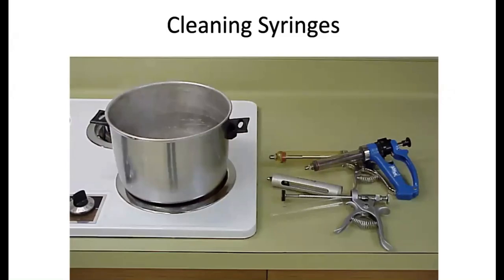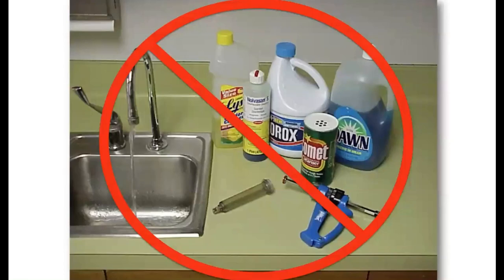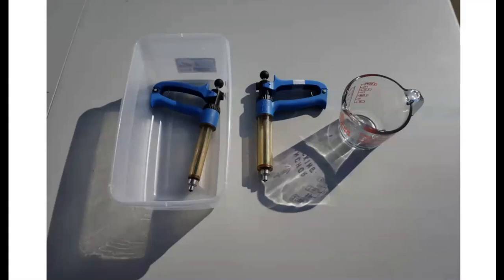So the question is, if you do go ahead and purchase these repeating syringes or multiple dose syringes, how do you go about cleaning them? There's definitely some things we don't want to do. We don't ever want to use any kind of soap, disinfectant, bleach, Nolvasan, Lysol, anything like that, because we can have some residue that gets left in the barrel, and that can reduce the efficacy of our vaccine after that. So then what are our options? There's a range of approaches people will use, from just using tap water, which to me is not sufficient, all the way to autoclaving, which most of us aren't going to have access to.